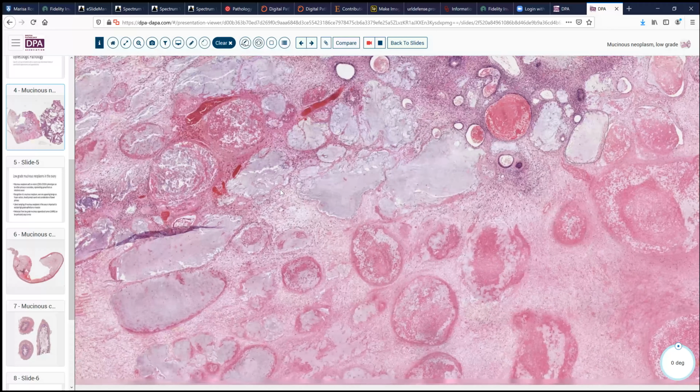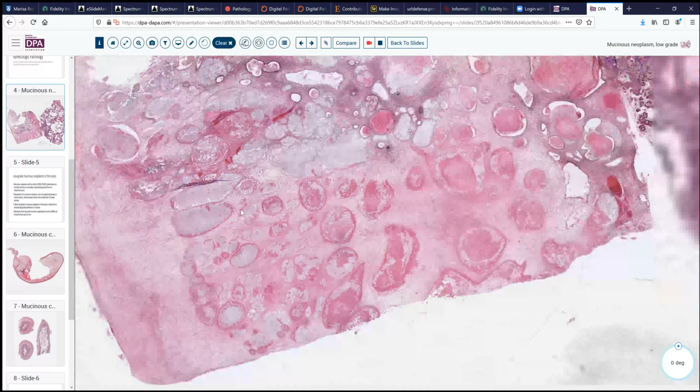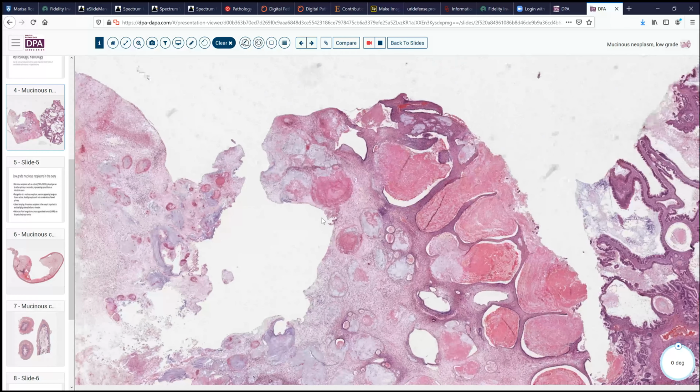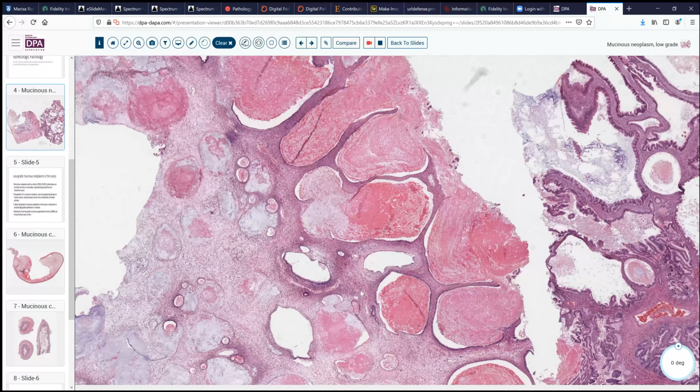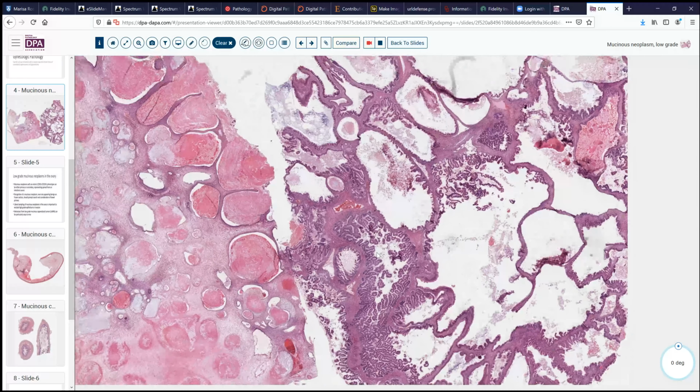Looking a little further, here we see there's been some generalized necrosis, perhaps a vascular-related issue. And looking at the rest of the tissue, we again see this same pattern of extracellular stromal mucin-like granulomas with eruption of debris into the lumen of the cystic spaces, but no desmoplastic single-cell infiltration, and really not too much in the way of high-grade atypia.